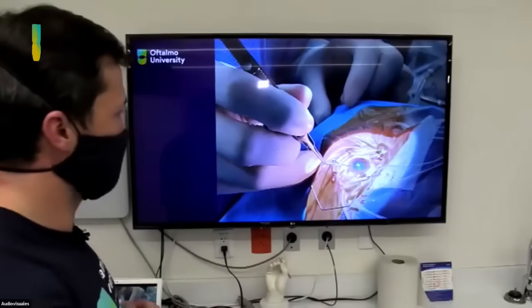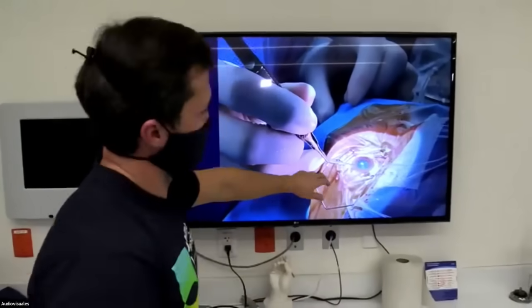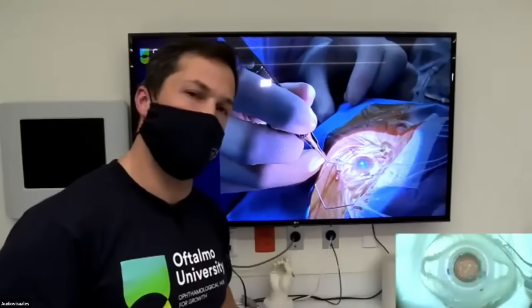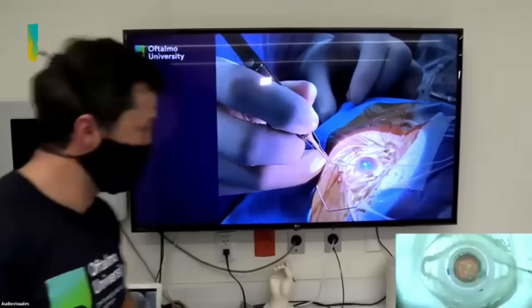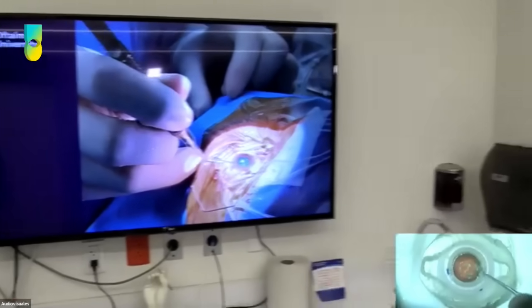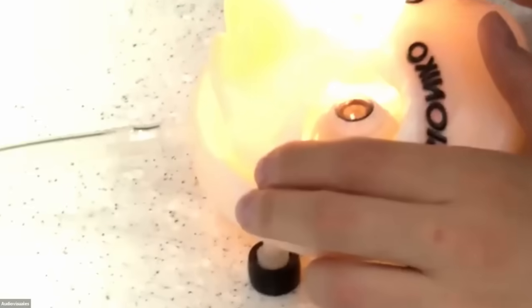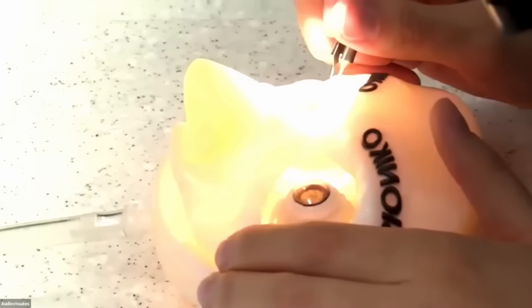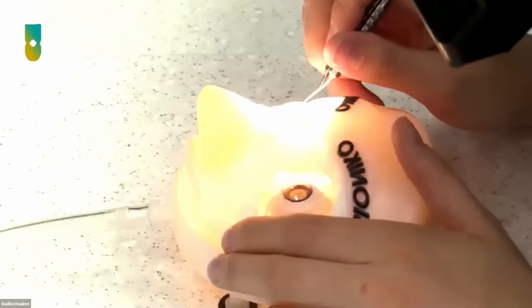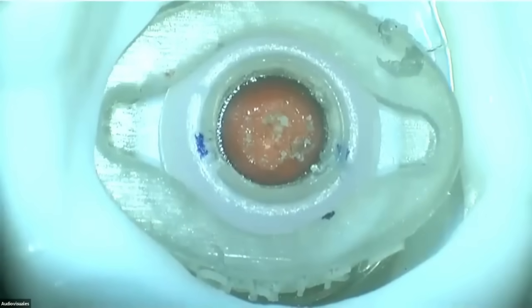Ashley, you were talking a lot about pivoting. Cecilia, what are your comments when you have a resident and you're seeing that he's moving the eye a lot, he doesn't have control, this viscoelastic is coming out? What are your thoughts? Now you hear me. The most important part is what Ashley said. You don't have to go back with your forceps. If you rest down back, the incision is going to open and you're going to lose all the viscoelastic out of the eye. You have to pivot there.